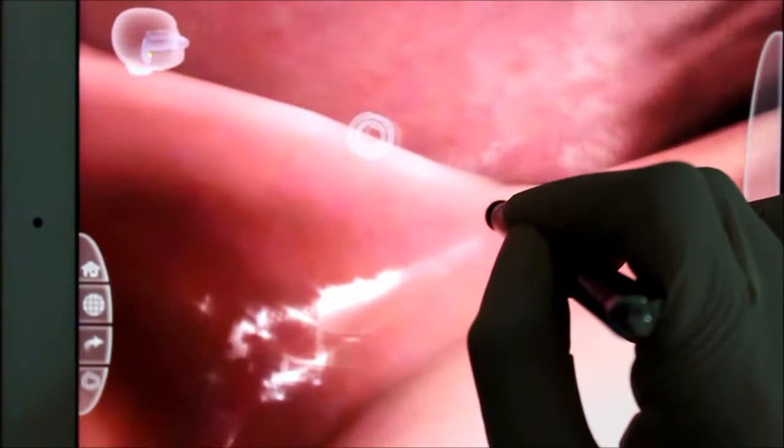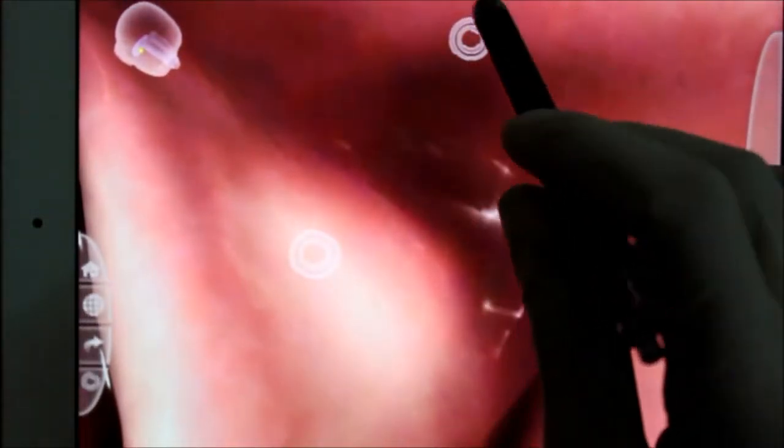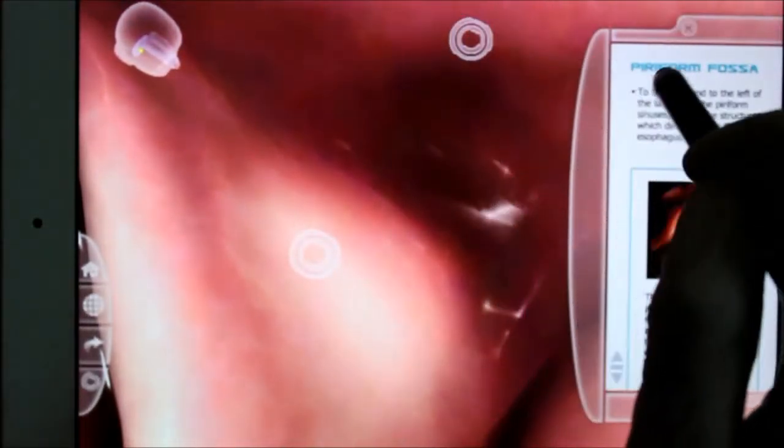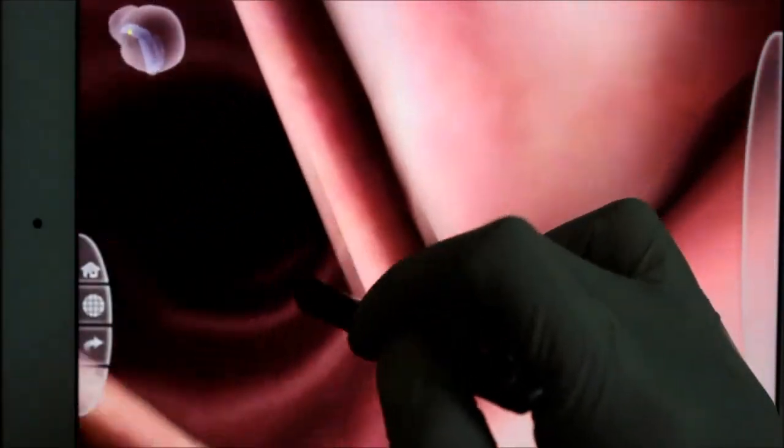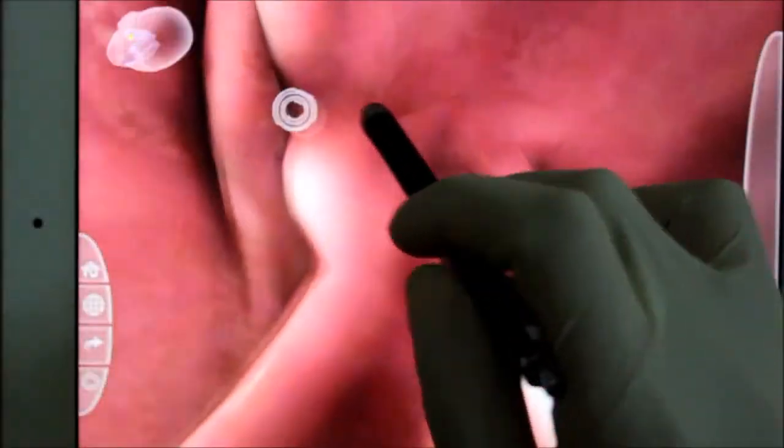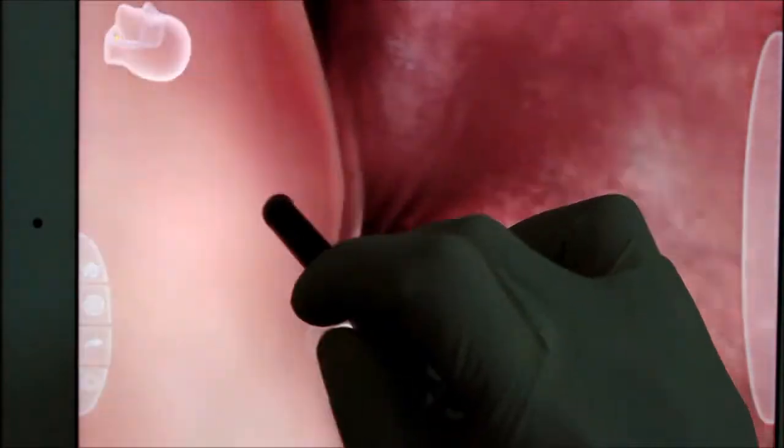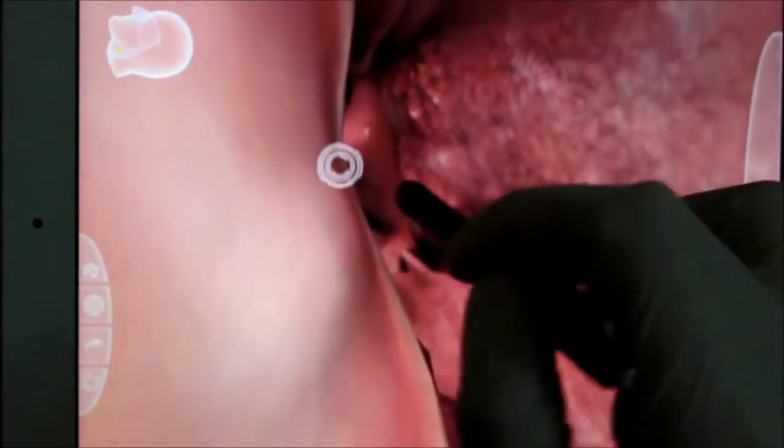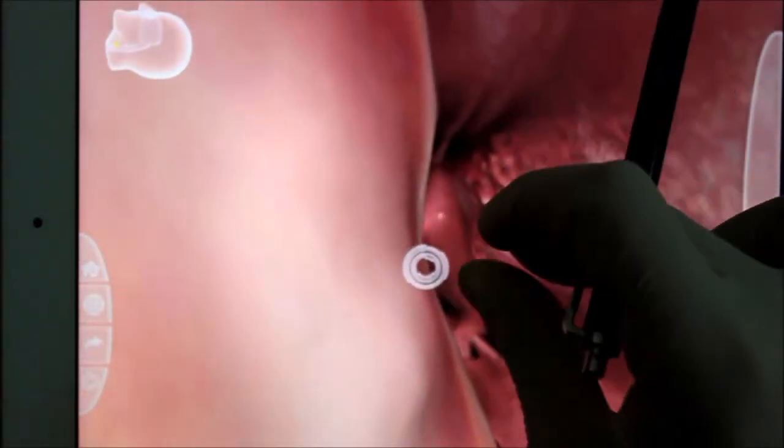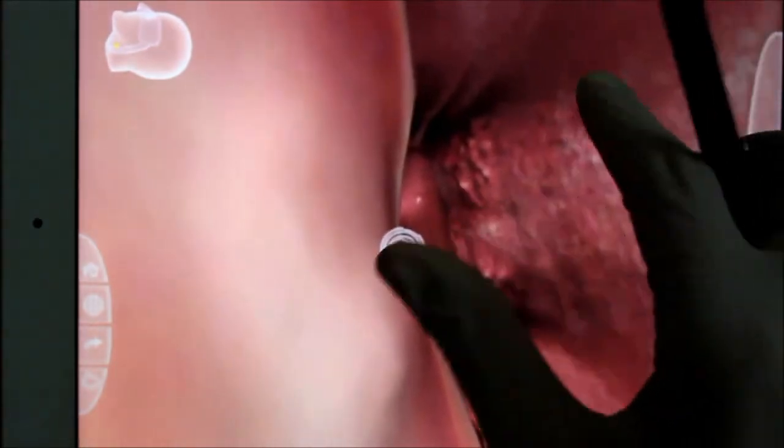Having said all about it, we nearly completed the lower airway part. In fact, we have completed the upper respiratory part and you can see it clearly.